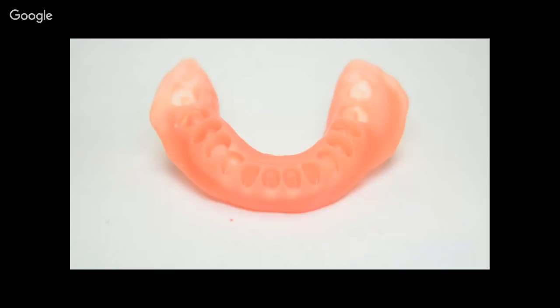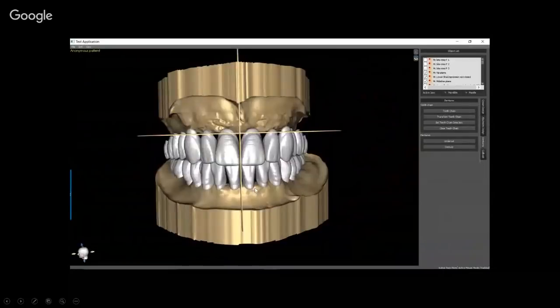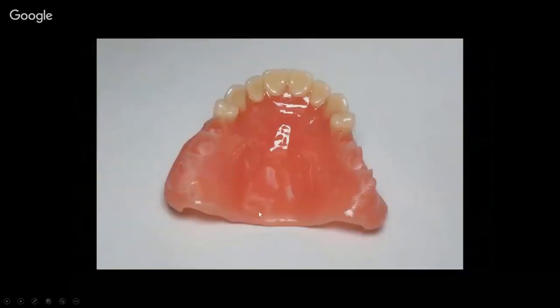And so here you see that base printed out. Do you notice how paper thin back here on the molars this is? That goes back to the whole principle of the software automatically trimming the teeth where needed. I don't have a good picture of it, but if you look back here, you see that these teeth are impinging into the model. So the software is going to trim that, and then it's going to maintain a 0.1, 0.2 thickness of base material so that those teeth will have to be trimmed to fit into these sockets.